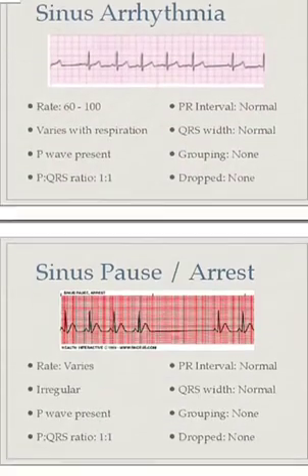Sinus arrhythmia, right? By sinus arrhythmia we mean that, if you have studied physiology, you must know that with every inspiration and expiration, heart rate changes. It is because of the function of the vagus nerve and its connection with the lungs and heart. Just consult your physiology book and you would come to know. So our normal rate is approximately 60 to 100.